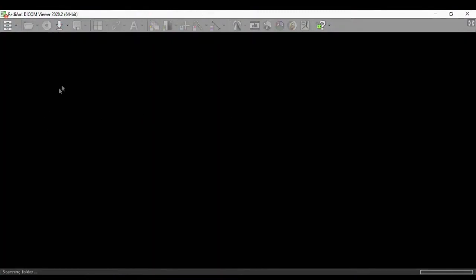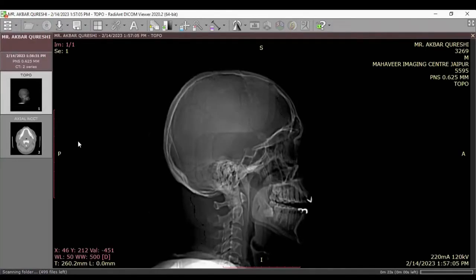The fluid you have used, is it hot saline or normal? No, sir. See, the hot saline concept is important for certain areas. It is not important for here. Hot saline is important in areas of the skull base where you see trabecular bone with a lot of venous channels, which bleed a lot.